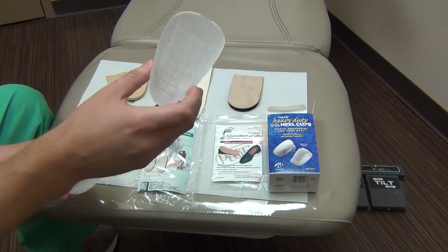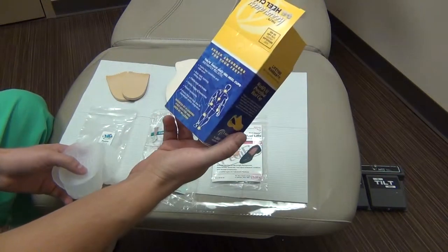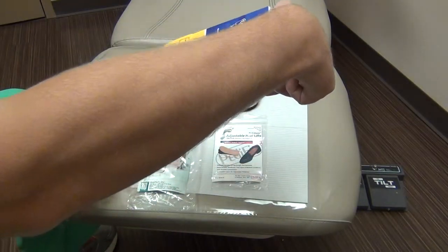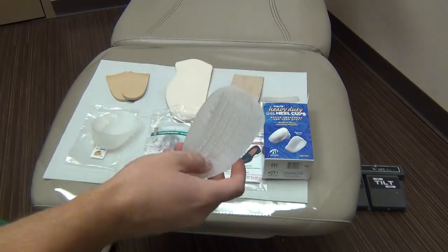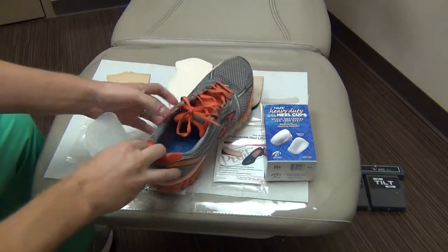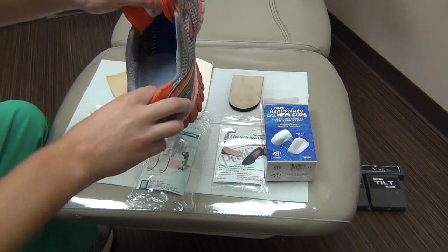These are fitted based on the patient's size. If you look in the box, they'll have instructions. In this case, this one's designed for patients that are under 175 pounds. What you do is take this and stick it in the back of their shoe — it just sits in the back. Obviously I have no liner in here; they'd leave their liner in their shoe.